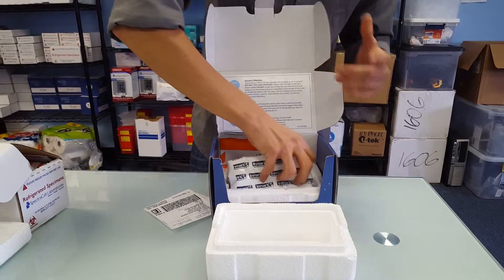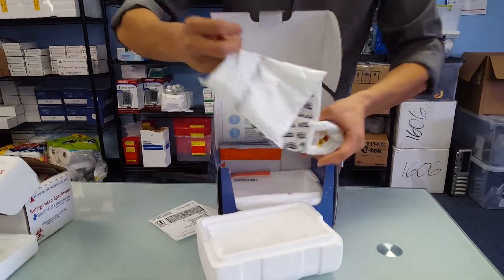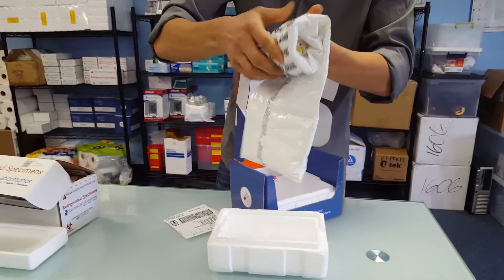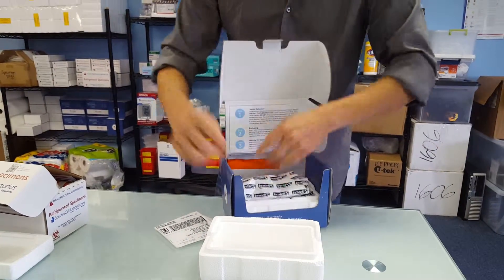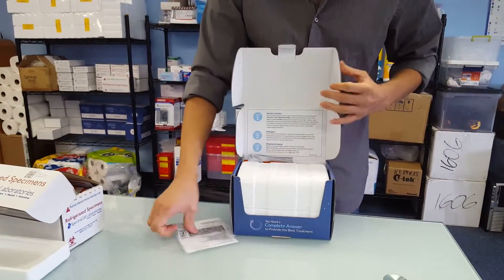And here we have the freezer pack that contains the tubes. Now this one also does not include any of the phlebotomy supplies, so Phlebotek historically will send those along with this kit so the phlebotomist has everything that they need to perform the collection.